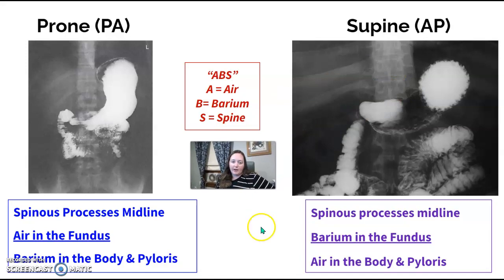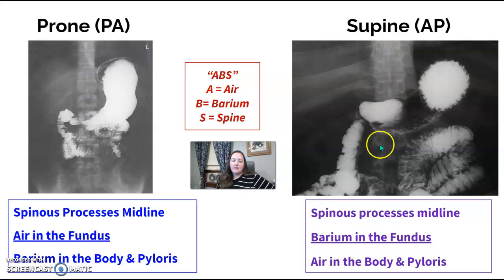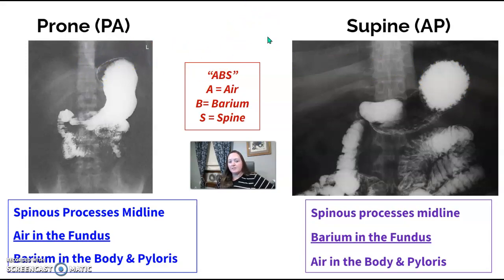When talking about supine or AP stomach positioning, look for what has air, what has barium, and how does the spine look — I call this ABS. When the spine has spinous processes coming straight down the middle, the patient is either supine or prone, because the spine is a true AP. Then evaluate whether the fundus has barium or air.